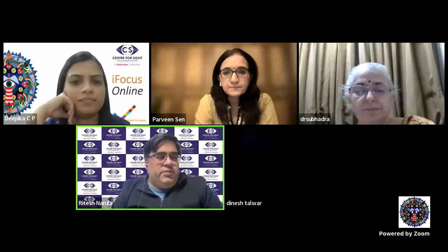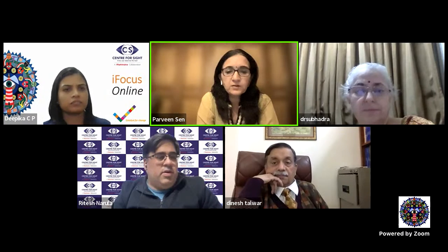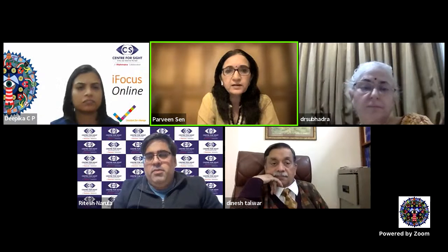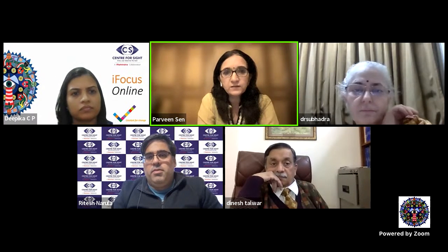Two quick questions. I think one of them you actually answered, but one of the students wants to know the status of pupil dilatation for multifocal ERG. Yeah, so it is done in a dilated state. We dilate the pupil and then do multifocal ERG. And we keep the refractive error correction in place for the focus, because whenever we do any ERG which has a pattern, whether it is multifocal ERG or pattern ERG or pattern VEP, refractive error correction should always be in place.